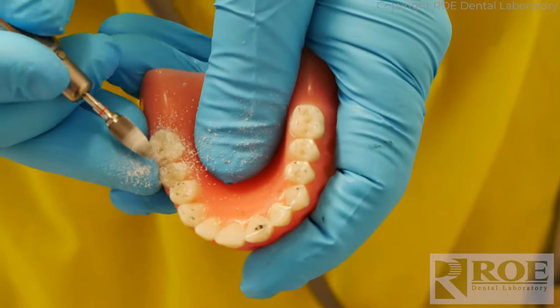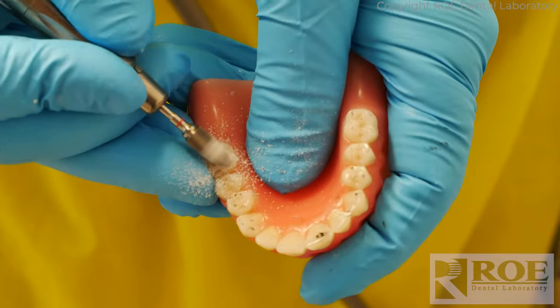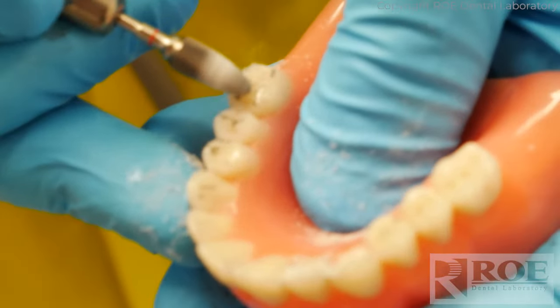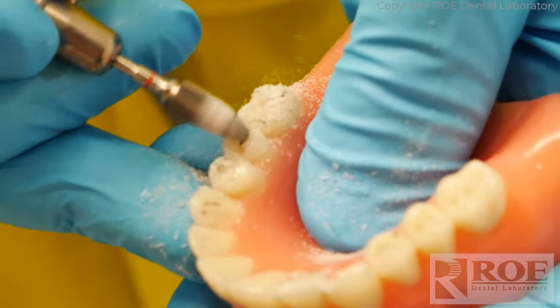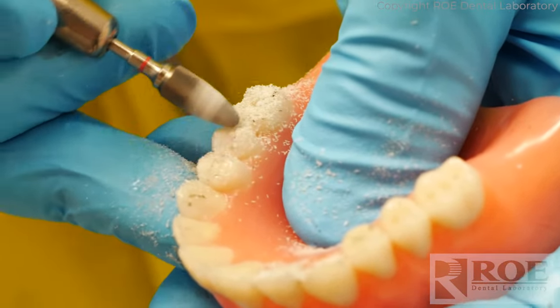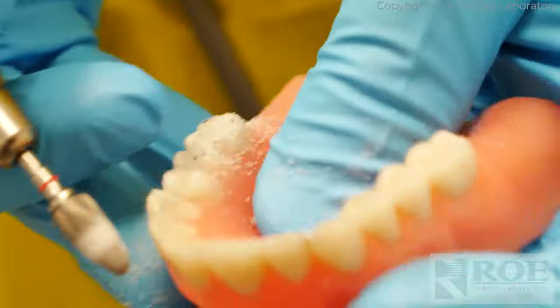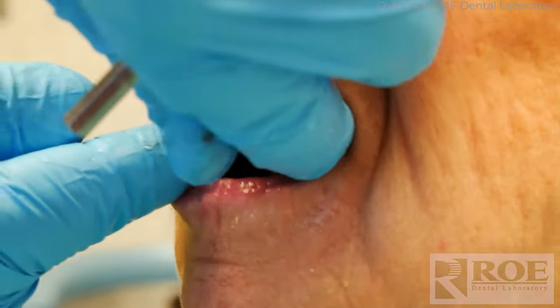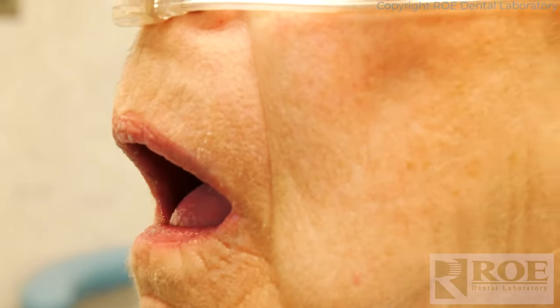We'll wait for later for that one — not going anywhere near the incisal, just there. Just a general adjustment of this. A general light adjustment of these. If any more, I might just ream out, so we'll see.